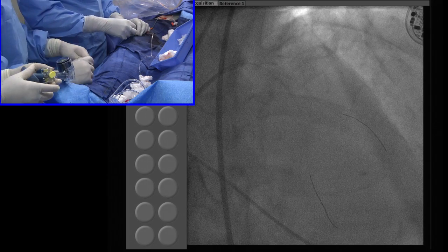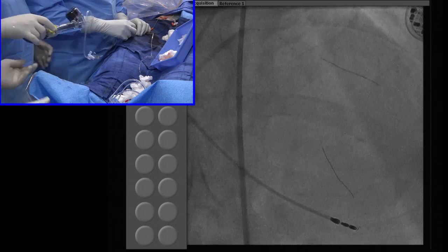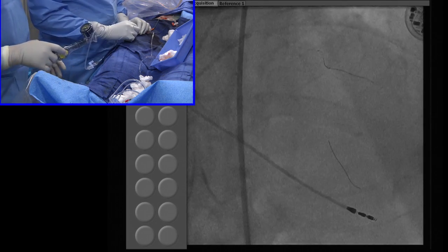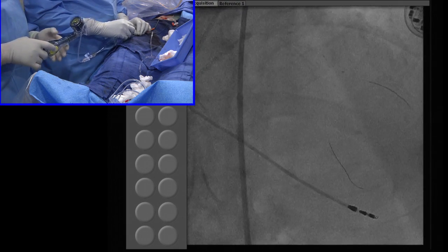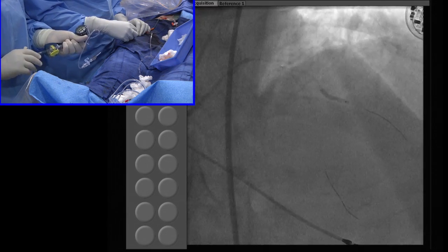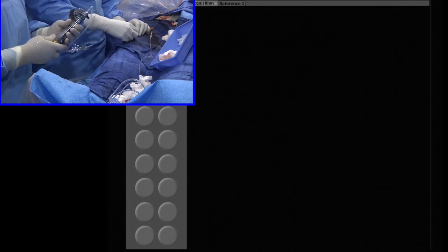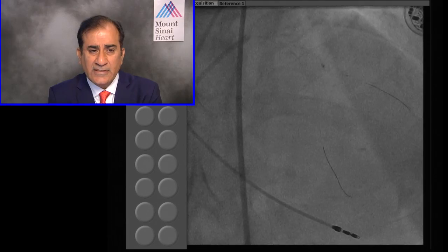Between IVUS and OCT, which would be a better modality for BVS? OCT, in terms of the detail of being able to see the struts and look at apposition of struts and expansion, but actually IVUS is probably just as good when you're talking about just looking at expansion, forget the struts problem, and the lesion is fully expanded. IVUS is, I think, just as good as OCT. But for looking at the individual struts and looking for apposition, OCT would be more accurate, as you saw in the data that Dr. Sharma showed you. Which would be more accurate for sizing?